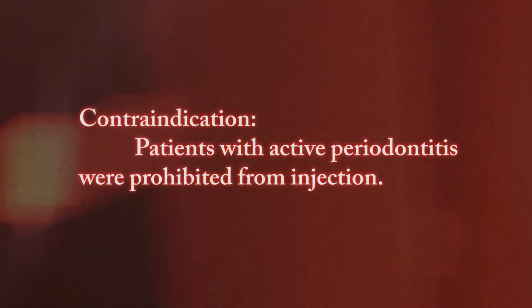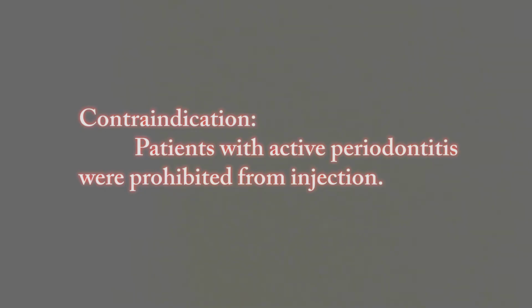Contraindication. Patients with active periodontitis are prohibited from this injection.